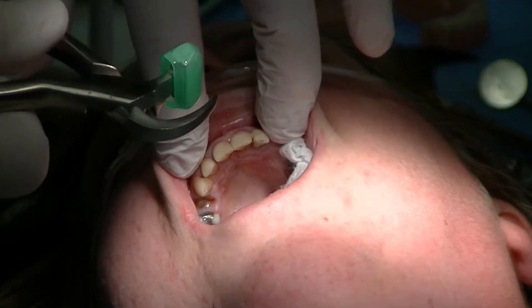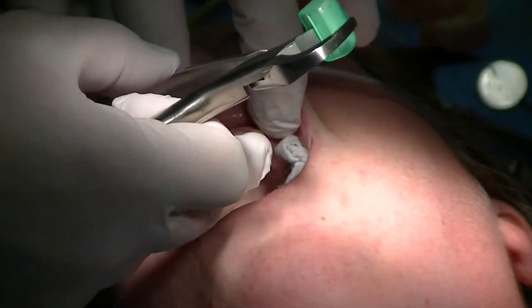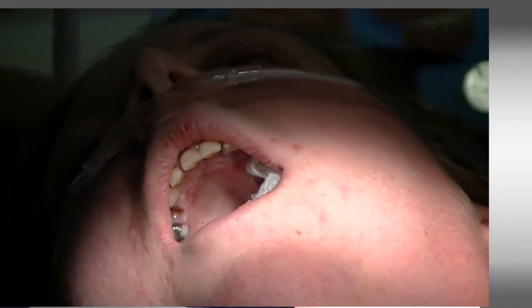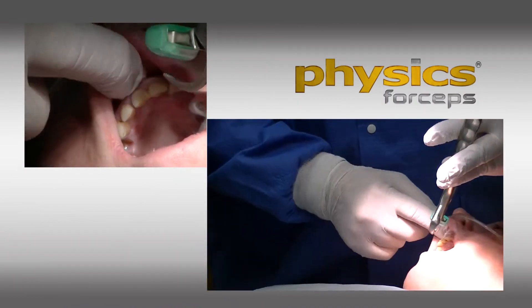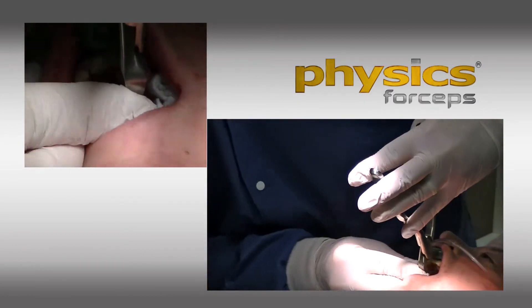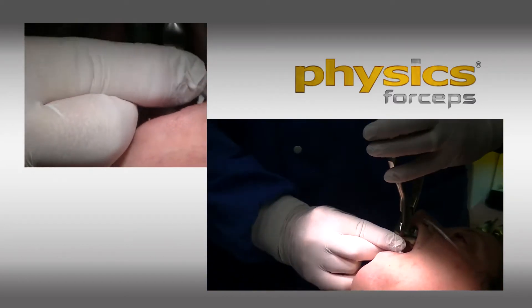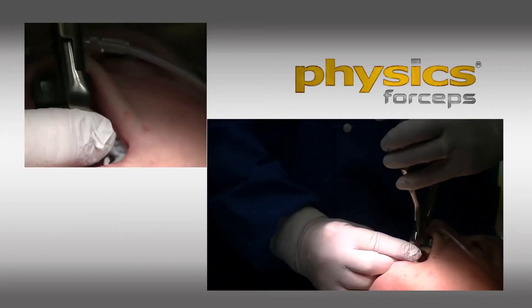Today we're going to do another full mouth extraction using the innovative physics forceps. We'll start with the central incisor — these teeth are very decayed. I'm a right-handed dentist, but for video demonstration it may be clearer using my left hand. I apologize for any inconsistencies due to filming.